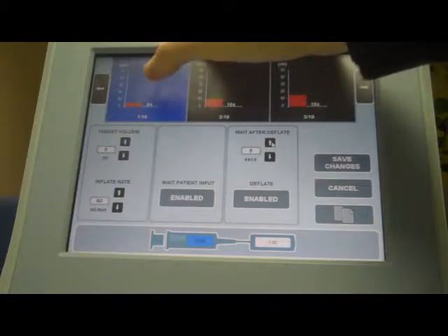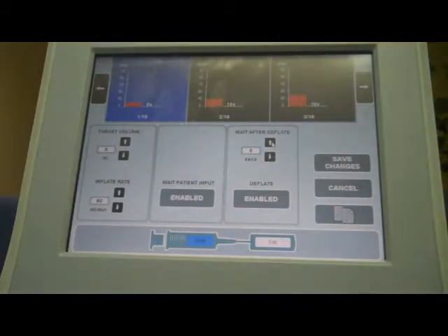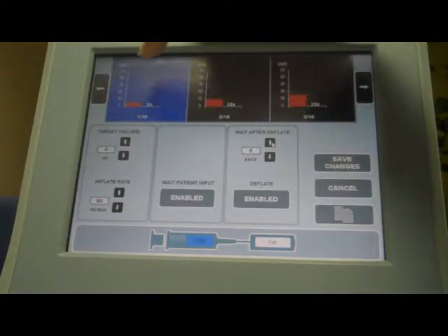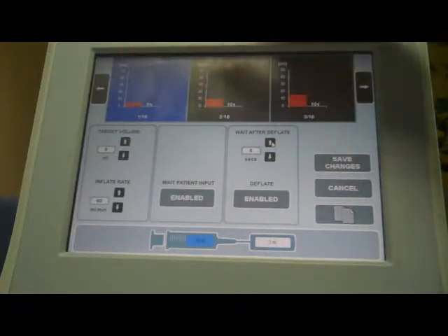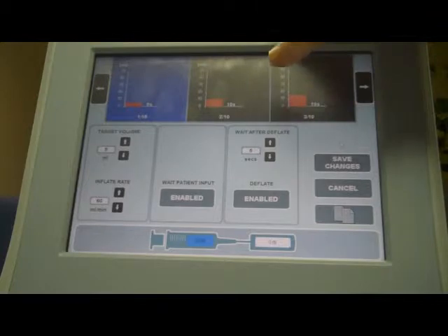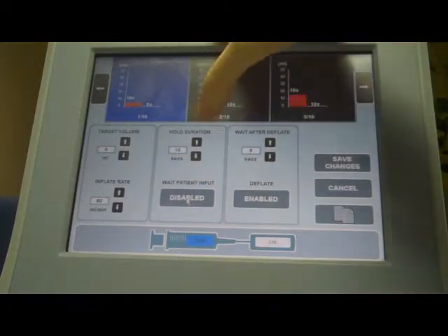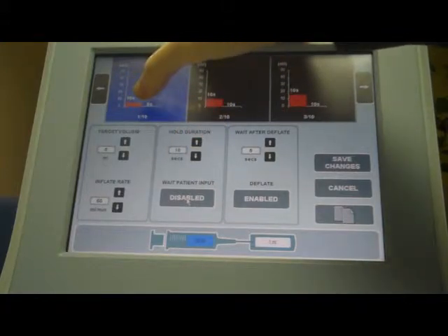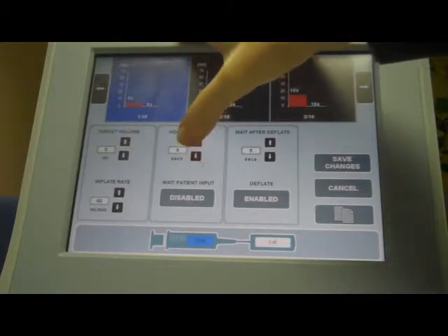Once you have inflated to the step, you have another option, which is wait for patient input. If you want the patient to enter a sensitivity value once you reach the target volume for that step, leave this enabled — the step will not progress until the patient has entered a value. If you don't want this, you can disable it, and then select how many seconds you want to wait at that volume before deflating. Here we have it at 10 seconds; we can bring that down to 5 seconds.